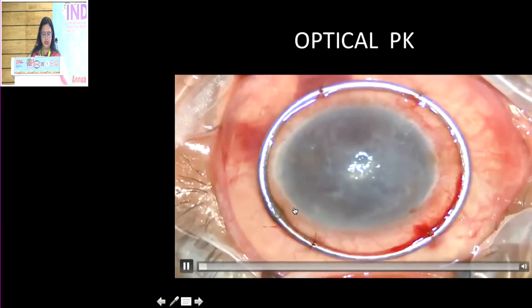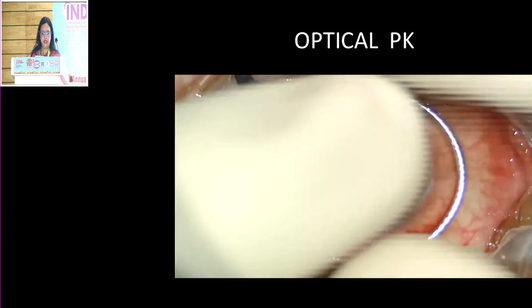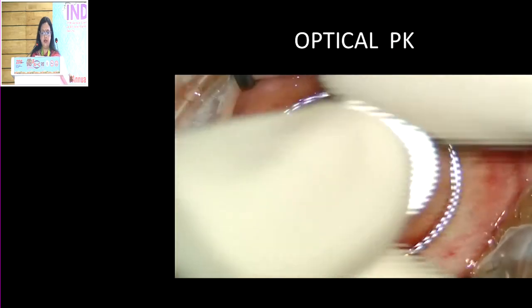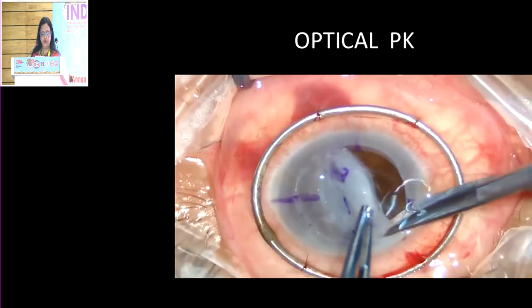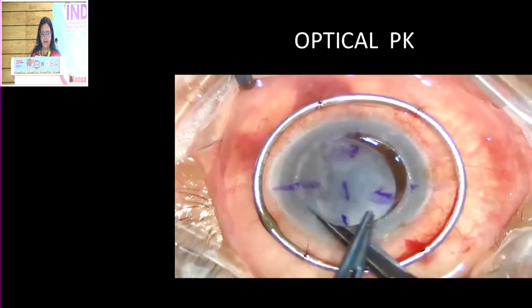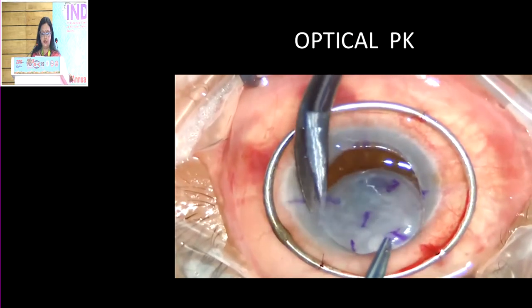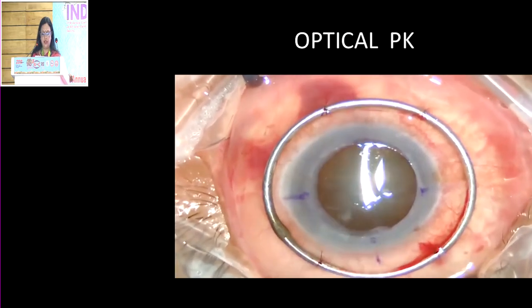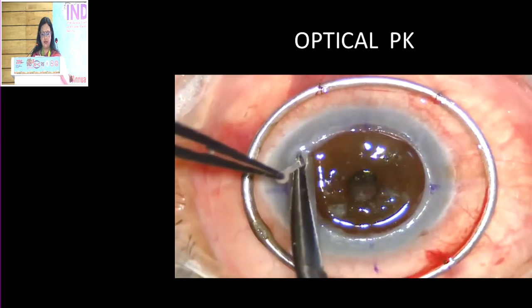This is how suturing is done — I'll go through the case of an optical PK. After measuring, I've taken about a 7.5 millimetre trephine. The host is going to be 7.5 and the donor is 8 millimetres. I'm using curved corneal scissors to remove the diseased cornea, and the edges are trimmed using Vannas scissors.